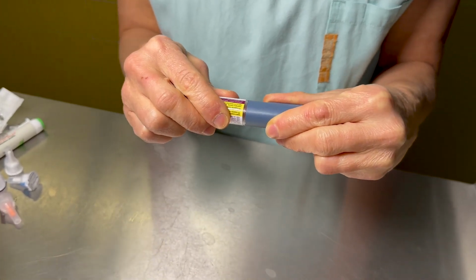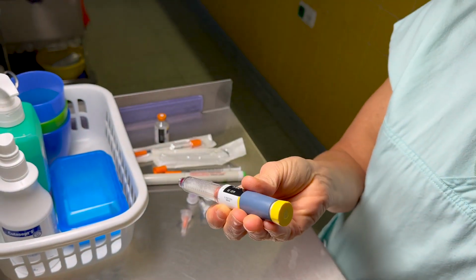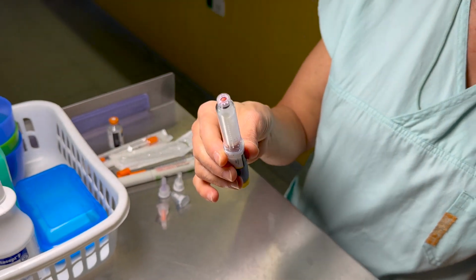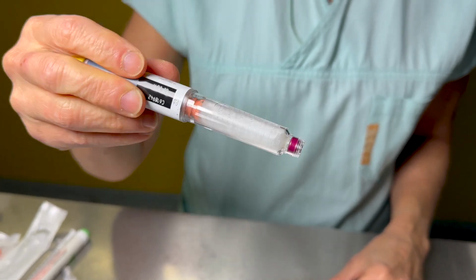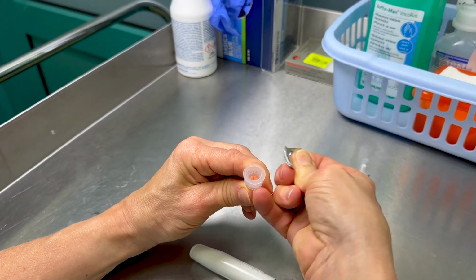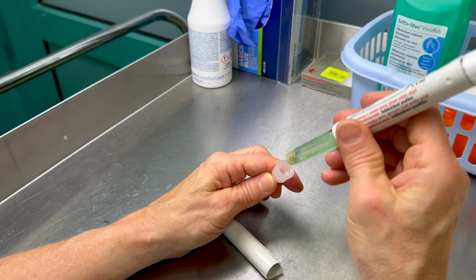Before each injection, ensure that the insulin pen is ready for use according to the manufacturer's instructions. Cloudy or mixed insulin should be shaken according to the manufacturer's instructions by turning the vial upside down and rotating it. A new needle should be used for each injection. The needle is no longer sterile after its first use.